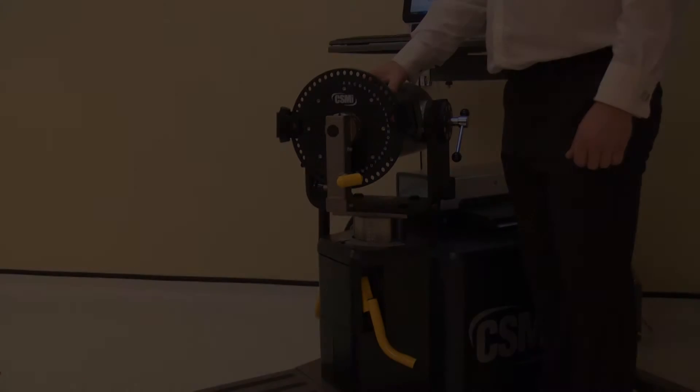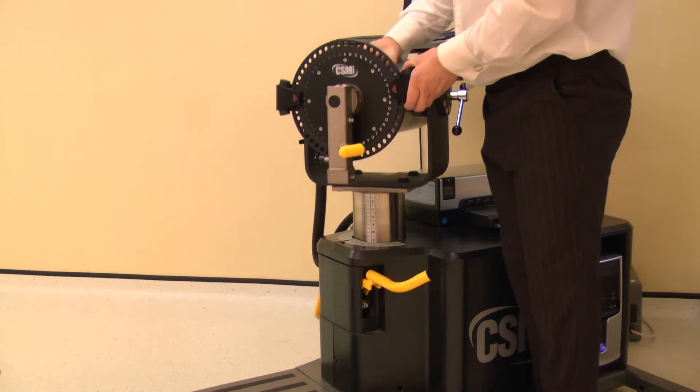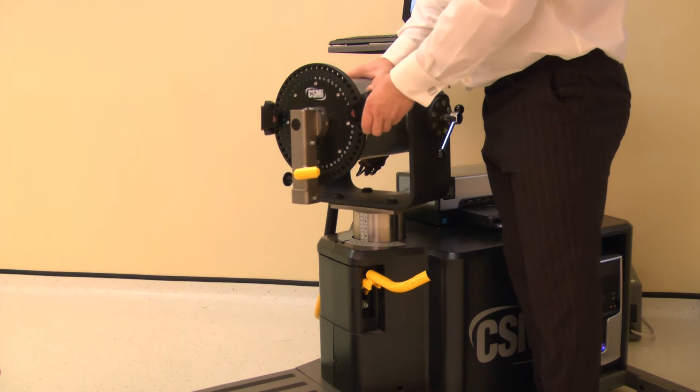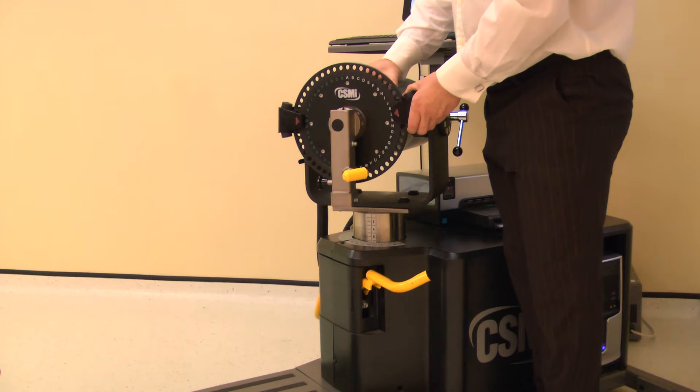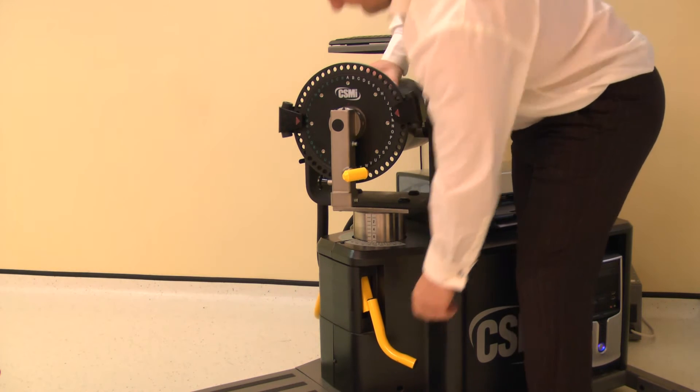The dynamometer height and rotation are adjusted together. Lift the locking handle to release. Rotate the dynamometer to 10 degrees on the black scale, whilst also adjusting the height to position 28 and a half. Ensure both locking handles are pushed down to secure.